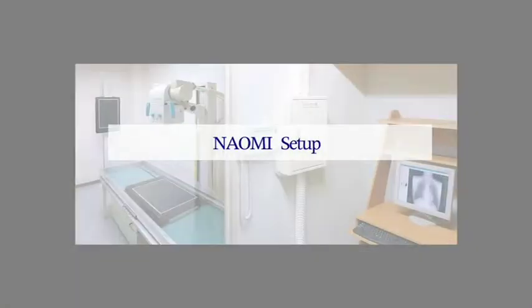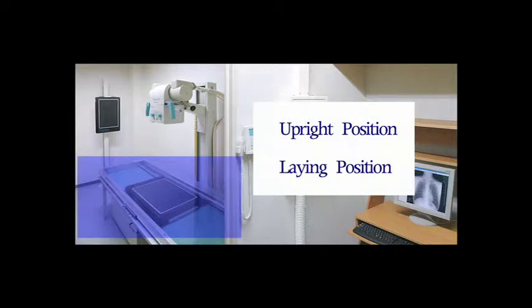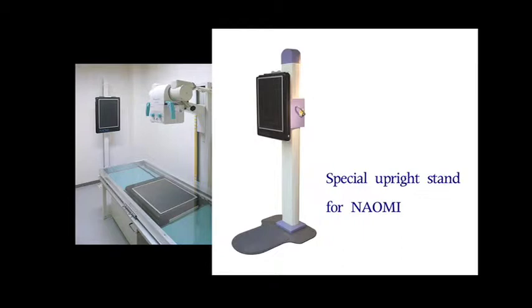Then you are ready to bring the Naomi to the place where you take X-rays. For taking X-rays, there are two positioning ways: one is the upright position, and the other is the recumbent position. You have to put the Naomi where you take X-rays. For upright positioning, you can use Naomi with a special upright stand for Naomi, or you can use Naomi with the existing upright stand in hospitals.